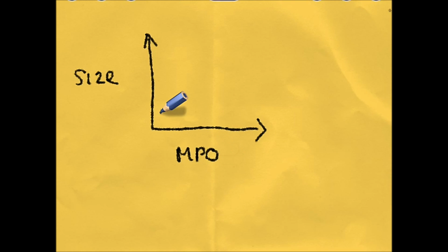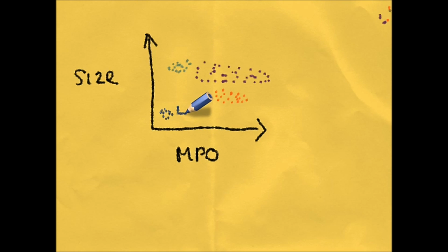So, for example, lymphocytes are very small cells which don't bind myeloperoxidase very easily. And neutrophils are larger cells which bind lots of myeloperoxidase. This graph isn't an accurate representation of what the analyzers produce, but it just simply shows the principle. Basophils have slightly different properties, but they're analysed in a similar method, but just in another channel.